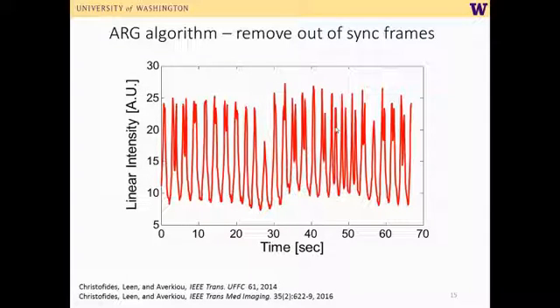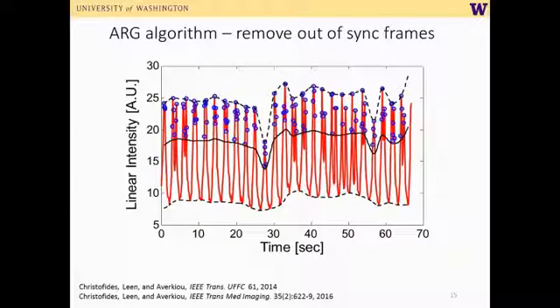So this is the respiratory motion. This is the extent of the respiratory motion, for example, how much the diaphragm is moving. And you can choose to limit the respiratory motion by thresholding and keeping only the frames at the same part of the respiratory cycle.